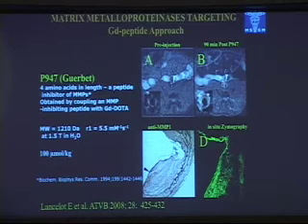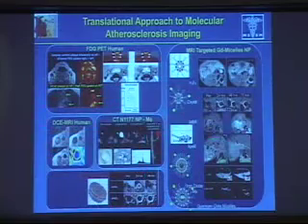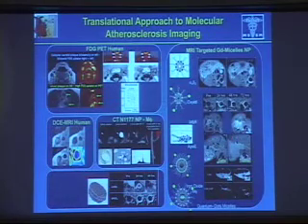So if you have a target that is expressed in high enough concentration, and I'll pick an example here that could be of interest in AAA, like MMP, or even thrombus, your strategy of imaging and molecular imaging will be different. Yesterday, I think Ahmed gave me a report that somebody talked about optical imaging and MMP. But in MRI also, I think we know that in plaque, MMP expression is fairly high. So if you have a broad MMP inhibitor, such as this MRI agent called P947, we've shown here in the rabbit model that we can image this MMP distribution. But when you don't have this, and you're looking at features that are smaller, such as macrophage density, which is lower in terms of concentration, you have to resort to this payload delivery system.